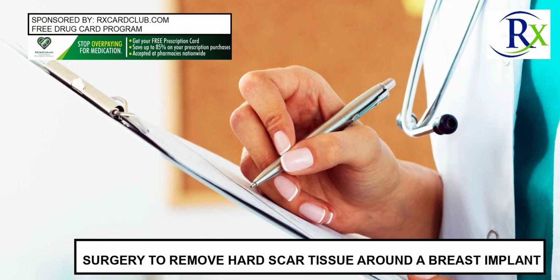The main types of capsulectomies are subtotal/partial capsulectomy, removal of some but not all of the capsule. Total/complete capsulectomy, removal of the entire capsule. En bloc capsulectomy, removal of the capsule and implant as a single unit.